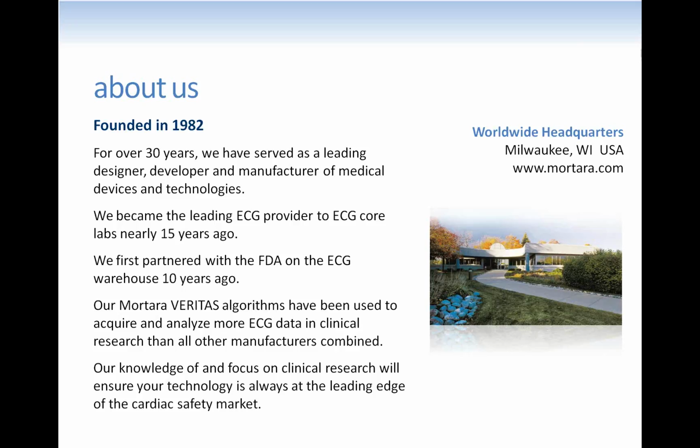And the ECG warehouse actually uses Mortara algorithms to analyze large quantities of data, specifically TQT studies that have been submitted in the past to the ECG warehouse for review by the FDA. We conglomerate that data within the warehouse, and then we apply our algorithmic tools to allow FDA reviewers to efficiently look through those large quantities of ECG data for any issues that they might be interested in within the data sets.